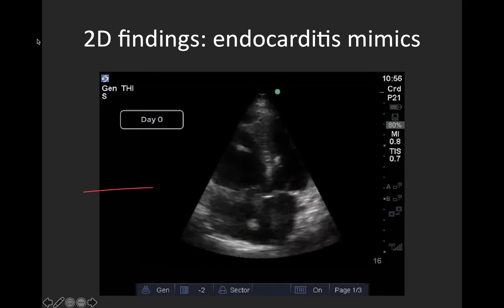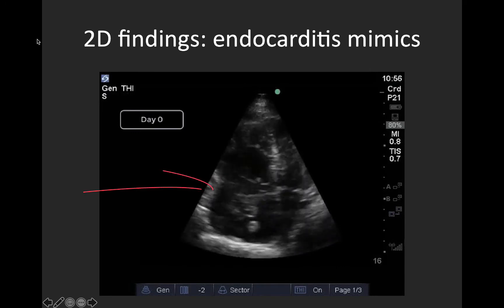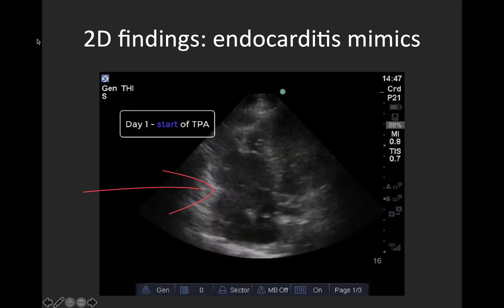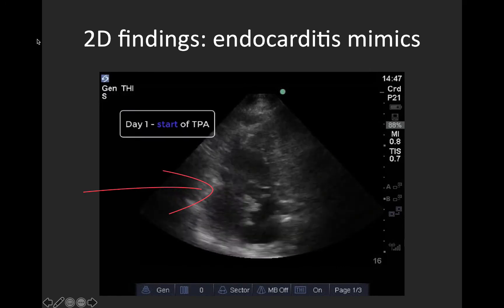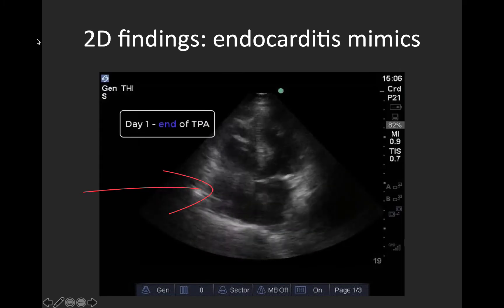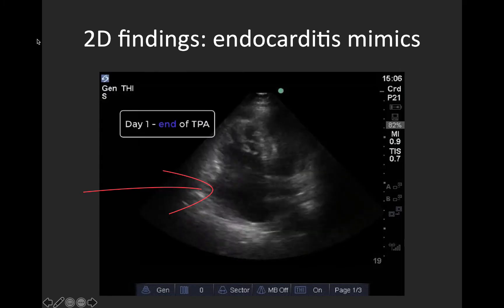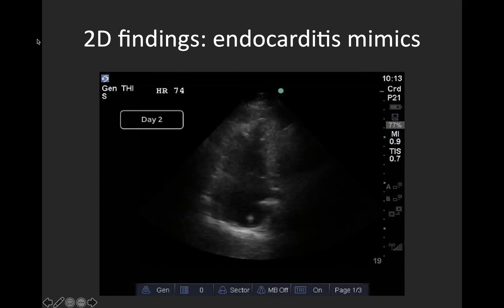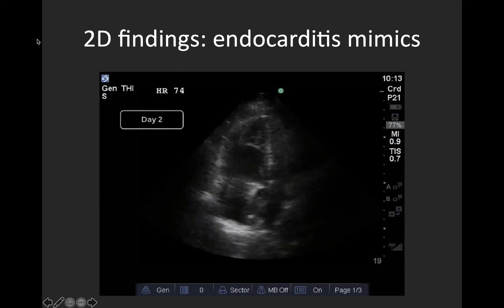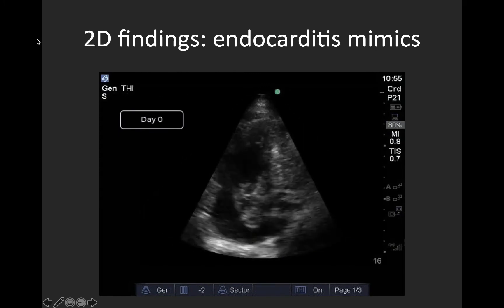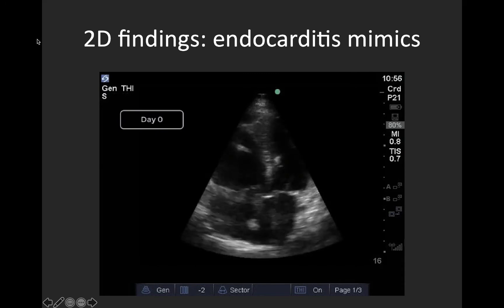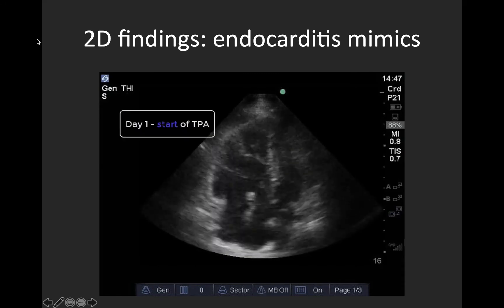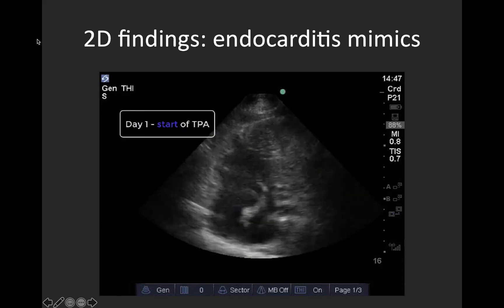This is a video showing an endocarditis mimic — a large right atrial thrombus. Notice that the density doesn't appear to be actually attached to the valve leaflets, in contrast to the previous clip. This is a time-lapse video showing the progression of the thrombus on presentation compared to after administration of tPA, and you can visually see the thrombus shrink, which is pretty cool.